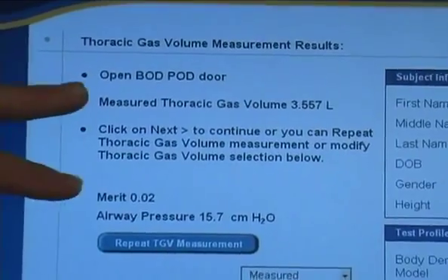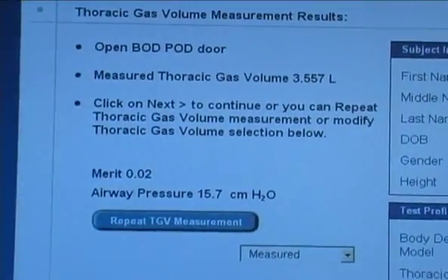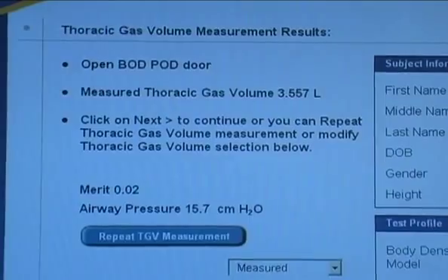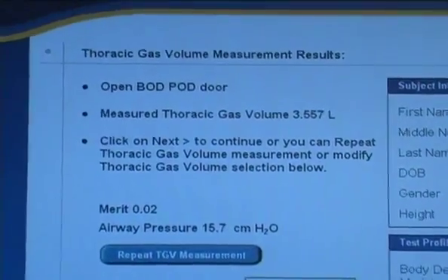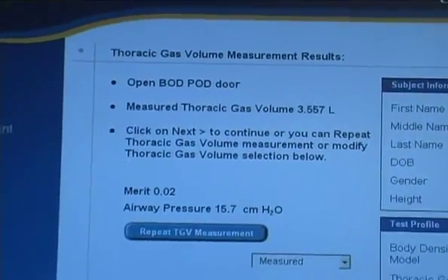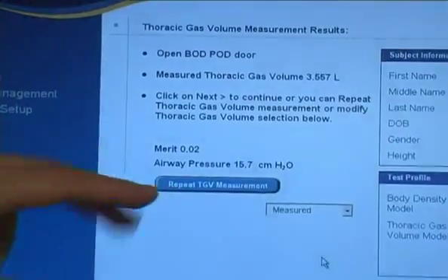It provides her measured thoracic gas volume, which is 3.5. Are you an athlete? Yeah. What do you play? Basketball. I kind of figured that by this, and I'll talk about that later about her value, which is good.